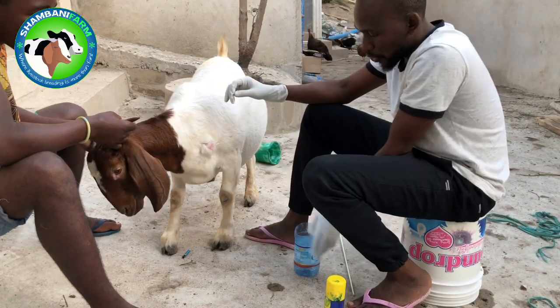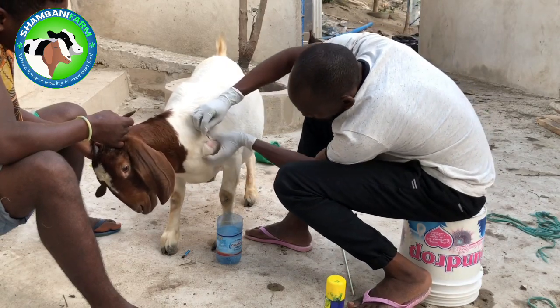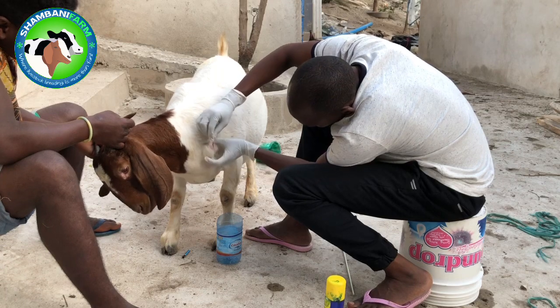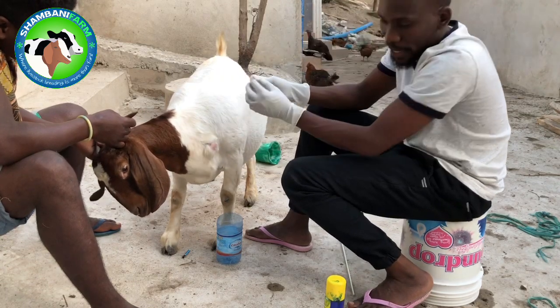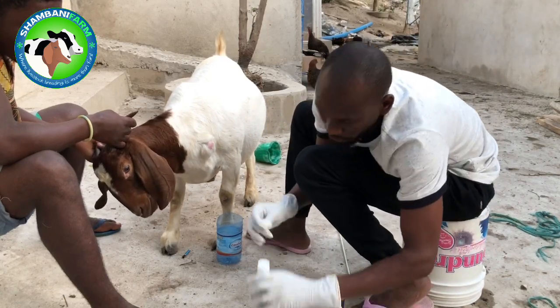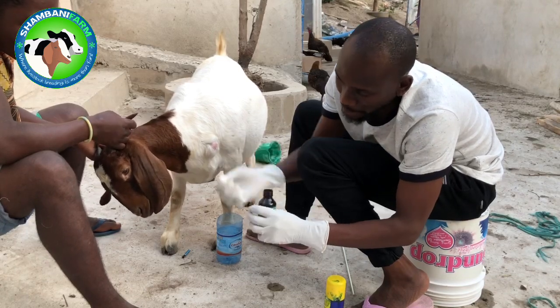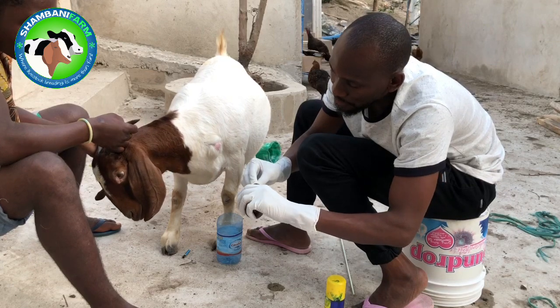Now we're going to create an opening here on the gut. I want to make sure that it's not such a big opening. But before I do that, I want to take a little bit of povidone iodine to prepare my wound area, to disinfect it.